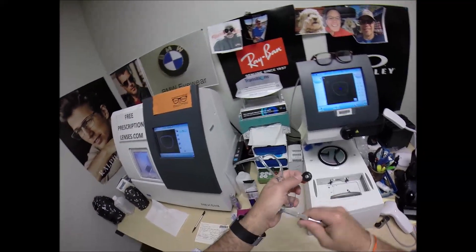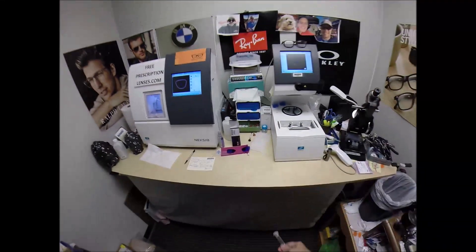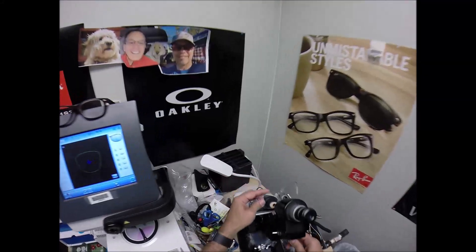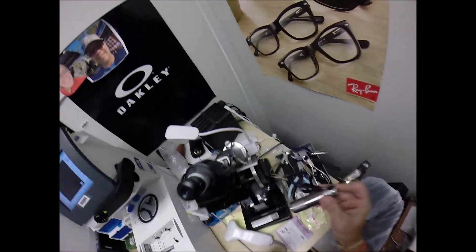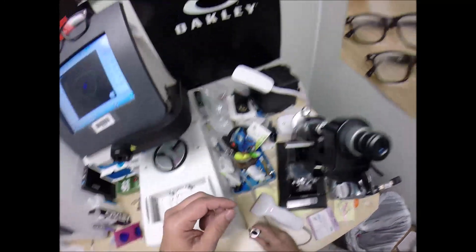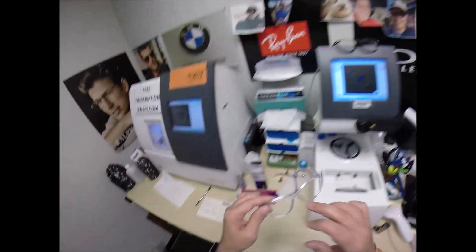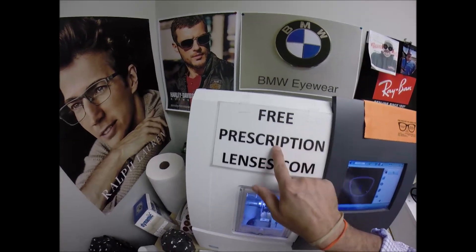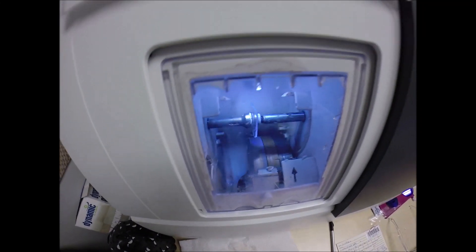I take the block off, dry that off, and do the old finger roll — add to my sticker collection. Come down here and read the prescription. Zero. No power. Plano — which is just another city in Texas. But this is known as final inspection; I'm just making sure that they were cut perfectly. And they were. I have to do that every day — it's just force of habit; I just want to make sure that someone didn't slip the wrong power lens inside that package.